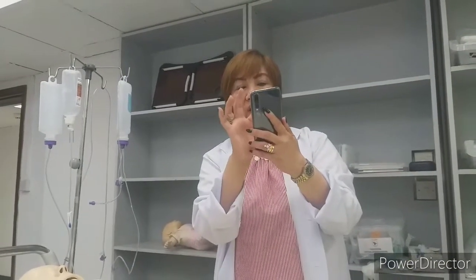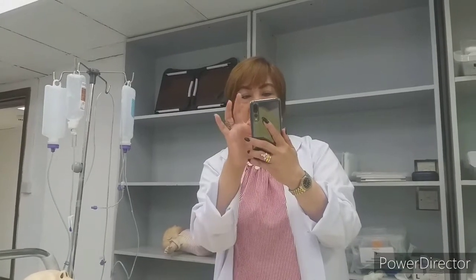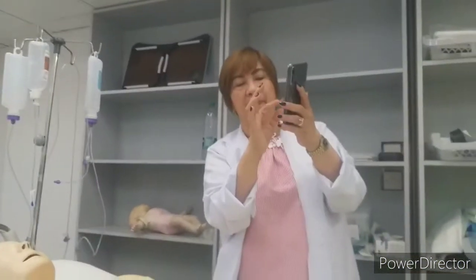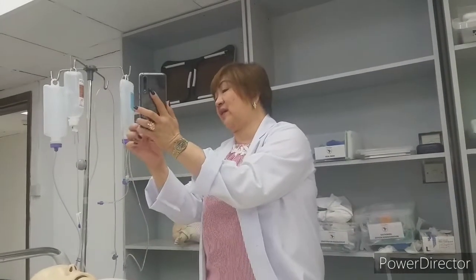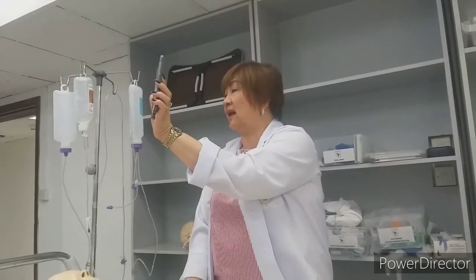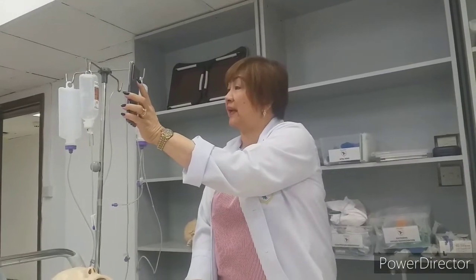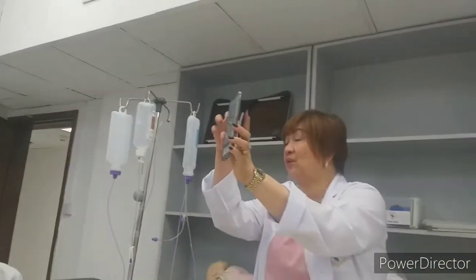Now, the colostomy care and the colostomy bag. Your colostomy bag is like this. There is a clip down, which means this is reusable.